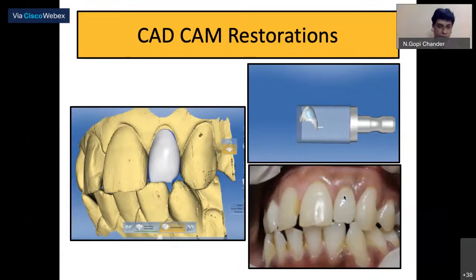But the process involved in coding and in terms of the hardware and software designing is going to be complicated. So that's the reason why I was explaining to you the technical aspects of augmented reality in the initial part of the lecture. The applications are very simple. You're just going to see certain things, design it, mill it, and fix it. But the concepts involved in getting these things are slightly difficult to comprehend. So once you know these terminologies, you can differentiate the things which have been used, and it's easy for you to understand.